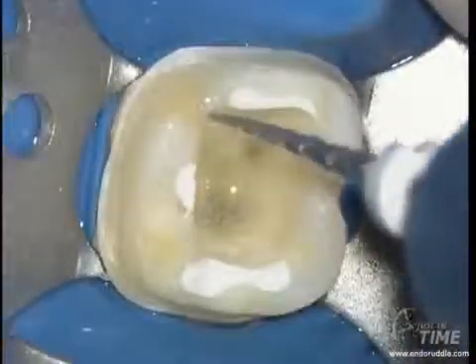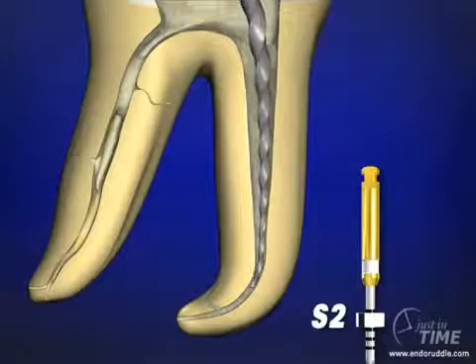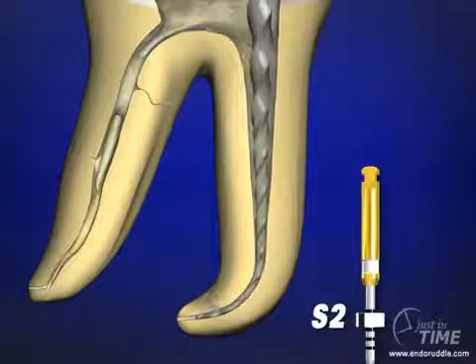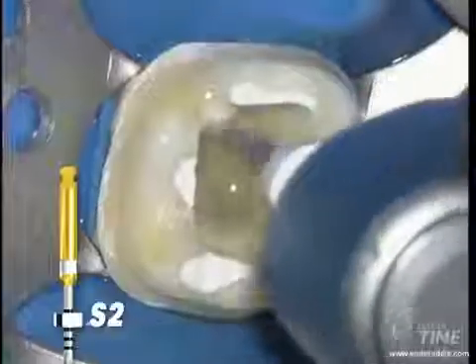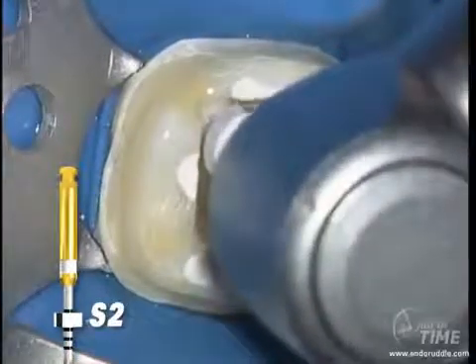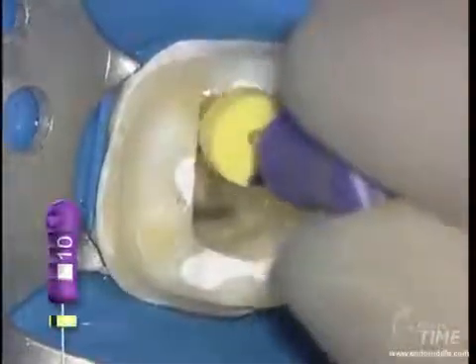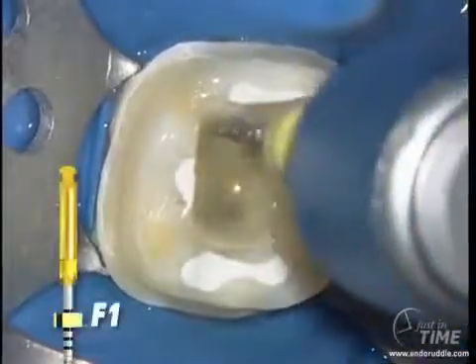The S2 follows the S1, and again in one or more passes the instrument can be carried to length. If the instrument doesn't want to go to length, remove it — recognizing there's a lot of debris accumulating in the cutting blades. Clear the blades, irrigate, recapitulate with the 10, and bring the S2 back in, and it will invariably move deeper into the canal and to length. Irrigate, recap, and re-irrigate. You're always one instrument away from victory, and one instrument away from a potential upset.